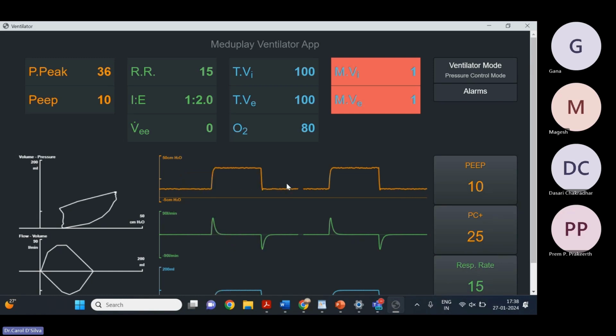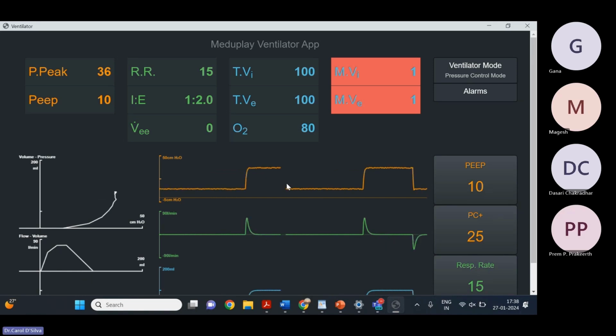You don't have to set it. Okay, you do set it in the alarm limits, but that's a little bit complicated. I won't tell you that. But remember, that's how it sets it. Okay, so pressure control PRVC, what you'll use is a pressure control.